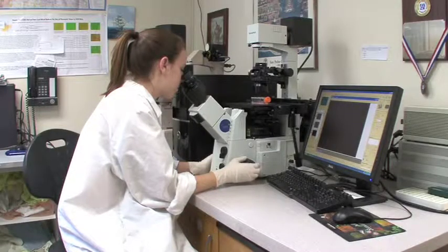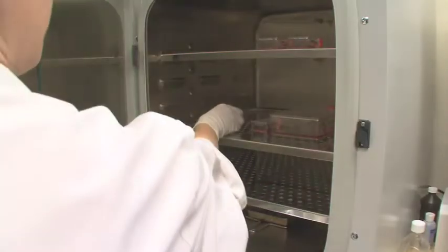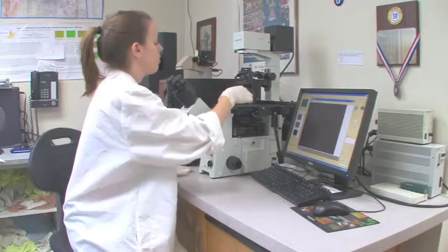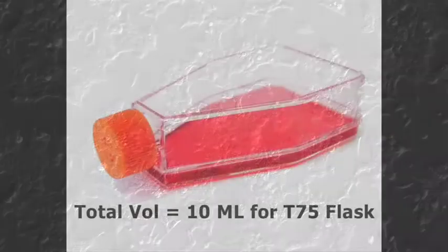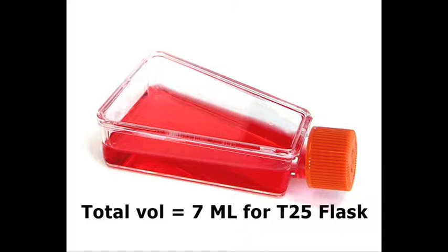Observe the cells under the microscope prior to placing in the incubator. Incubate at 37 degrees Celsius 5% CO2 in a humidified incubator. After 24 hours of plating, inspect the cells. Please note, if the attached cell density is low, combine with suspension cell pellet into a total volume of approximately 10 milliliters for T75 flask or 7 milliliters per T25 flask.